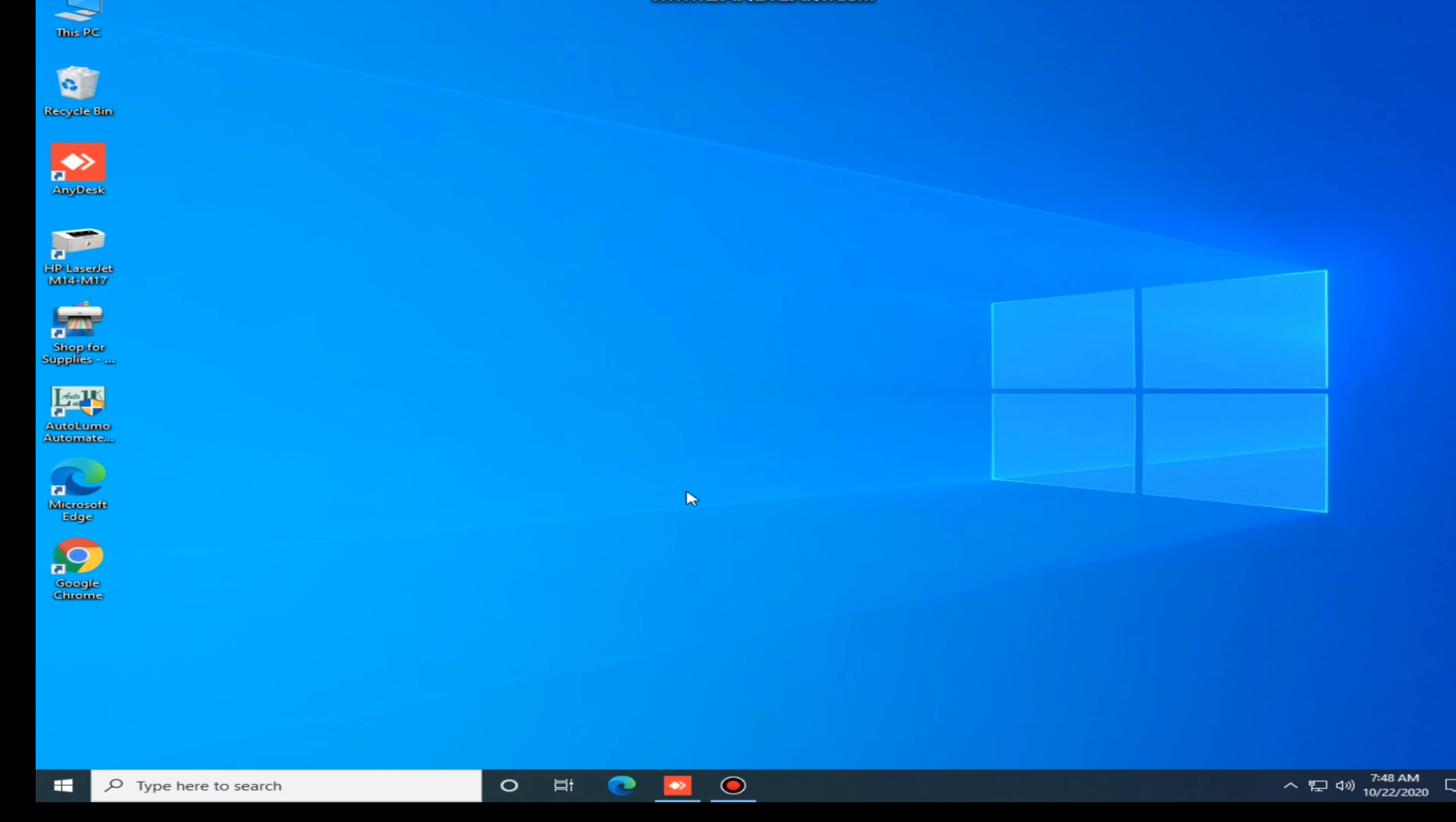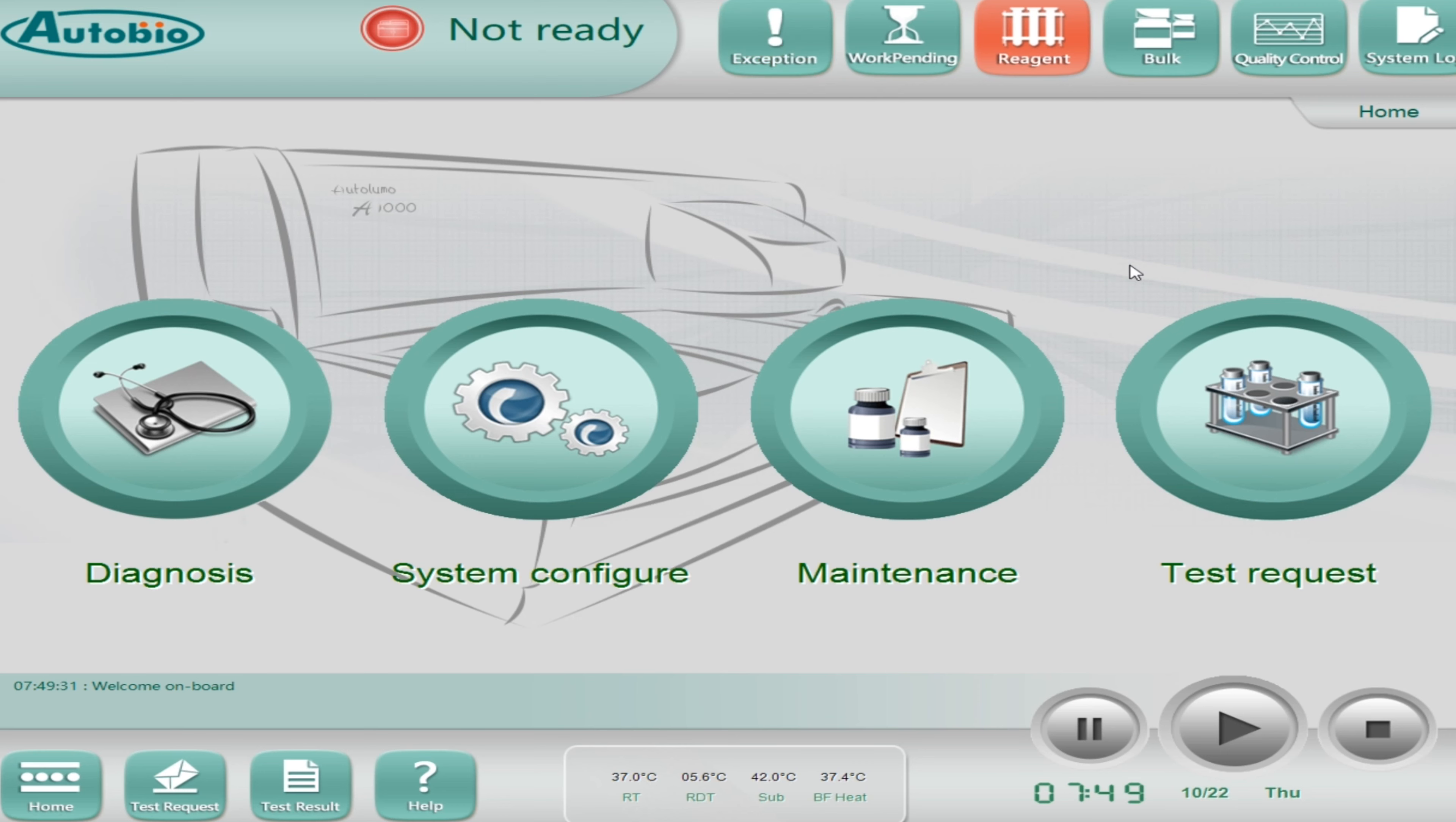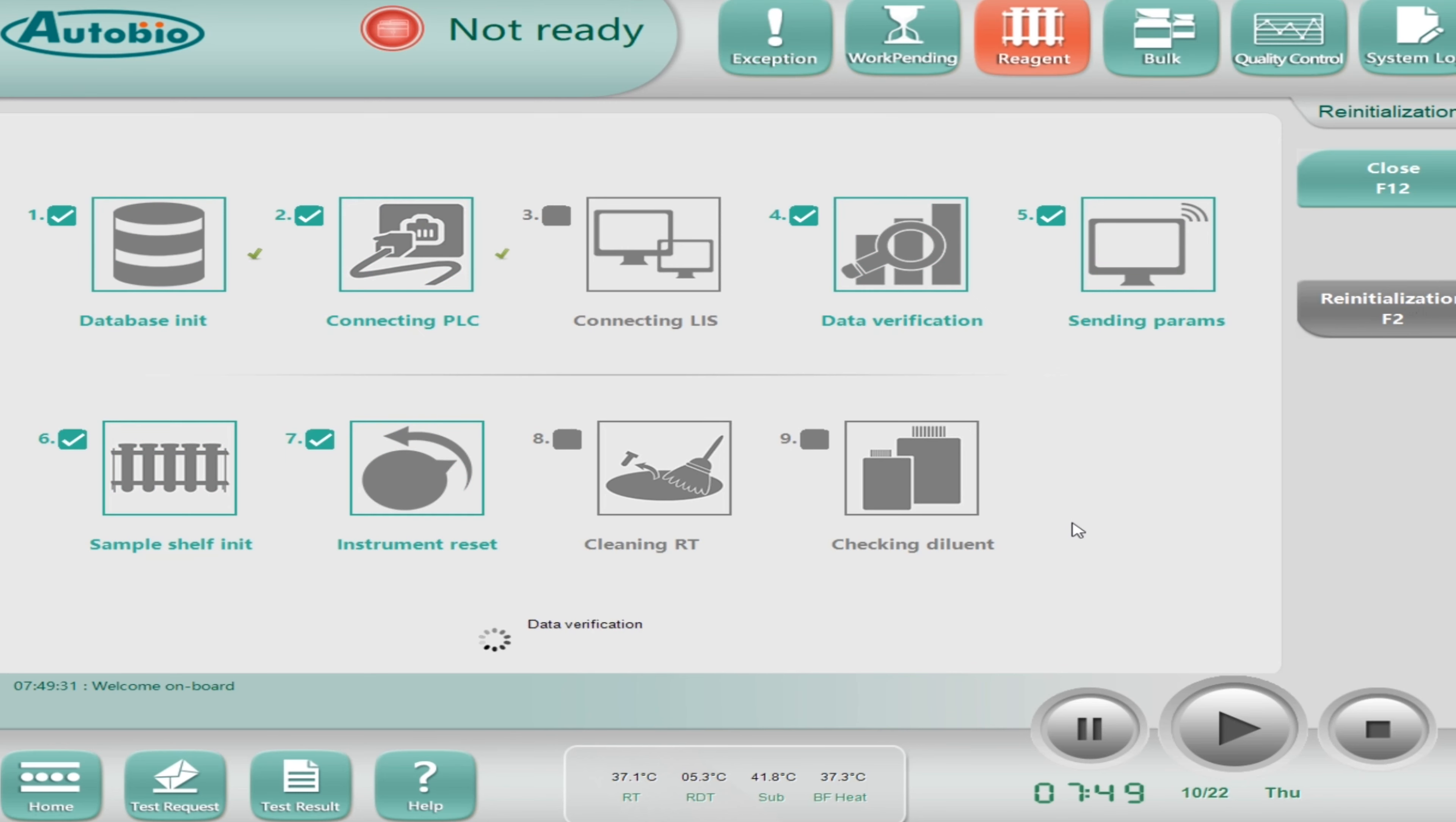Hello guys, welcome back to our new video. Now I'm going to show you the basic operation of immunoassay laser. Today I am with Autobio company and this model name is Auto LUMO 1000. This is an immunoassay laser and today I will show you how to run the calibration, how to do the QC, and how to perform the patient samples as well as I will also show you a little bit about basic maintenance.